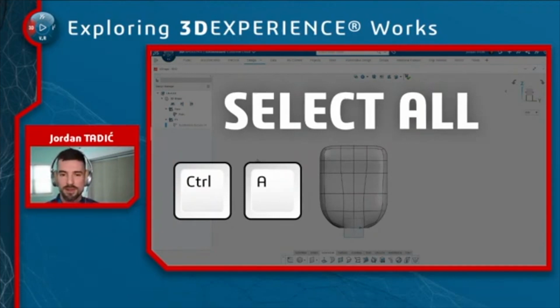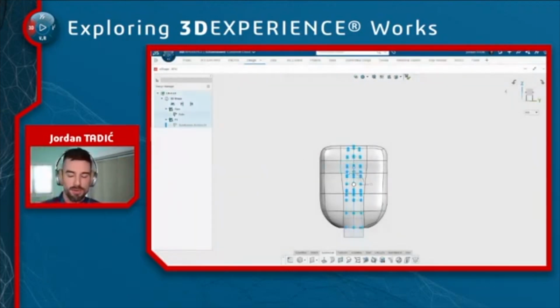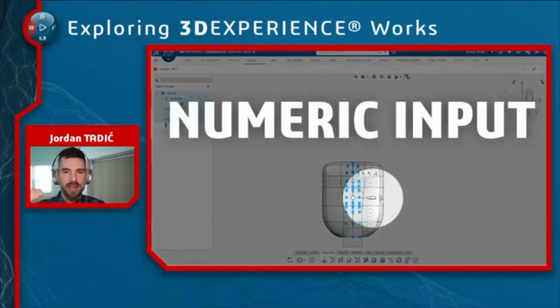So a keyboard shortcut to be aware of is Control-A. It selects the entire geometry, and now I can translate all those points together at once. But again, let's talk about precision here, right? So I could drag it up, and I could snap to the ruler that pops up on the screen, but sometimes the increments on that thing are every 1 millimeter, every half millimeter, every 5 millimeters. It might not be the precision that you want on the ruler because it's all dependent on your zoom level.